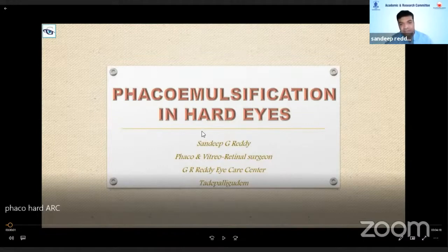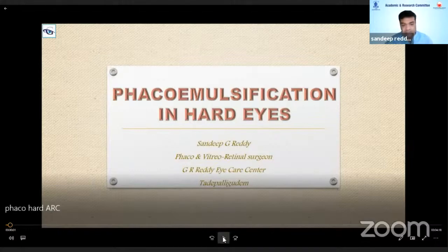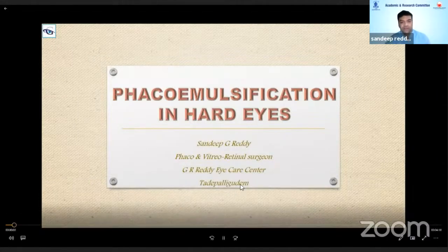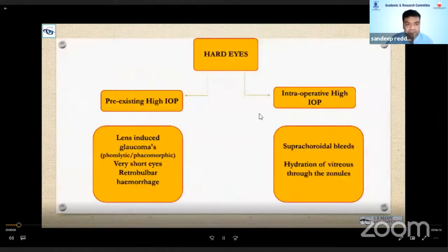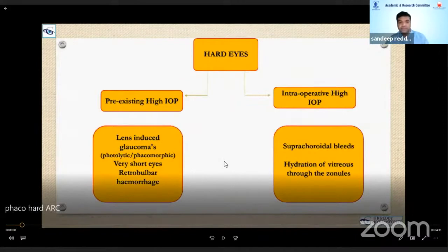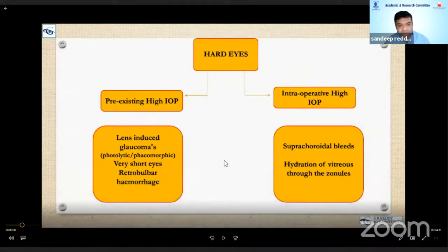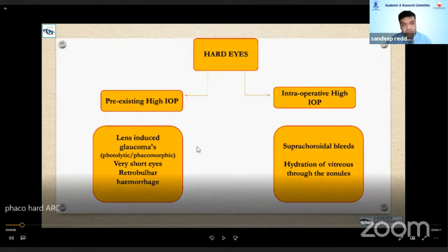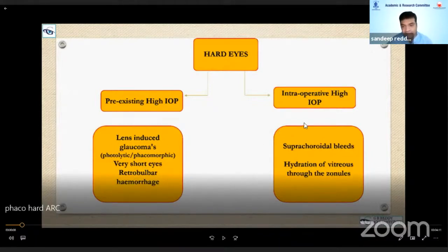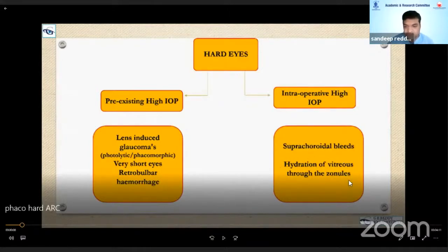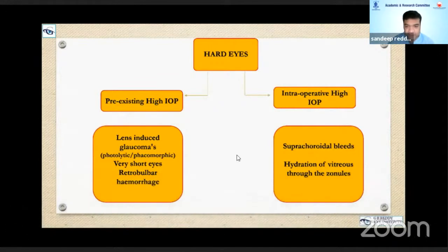I will be sharing my ideas of doing phacoemulsification in hard eyes. Hard eyes can be classified as pre-existing high IOP cases or intraoperative sudden rise of high IOP. Pre-existing high IOP, as you all know, can be phacolytic or phacomorphic. Sometimes sudden retrobulbar hemorrhage can cause pre-existing high IOP, or sudden rise of IOP can occur in cases of suprachoroidal bleeds or sudden hydration of vitreous. I will show you some videos where this happened and how we managed that during cataract surgery.